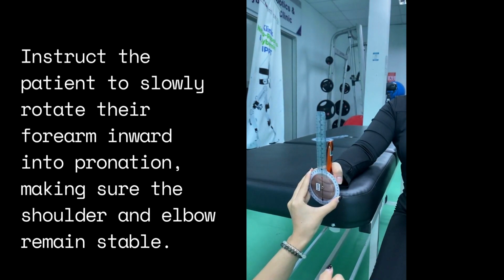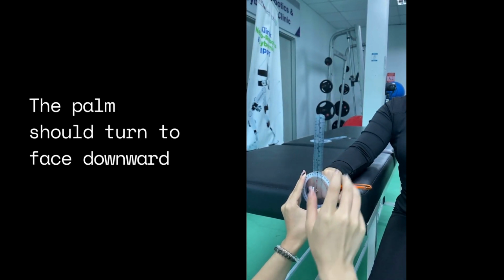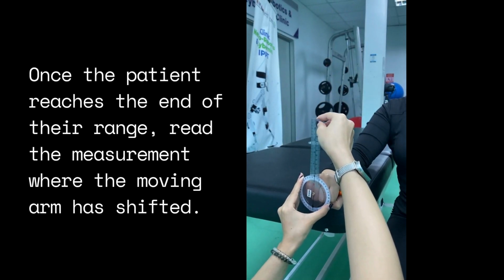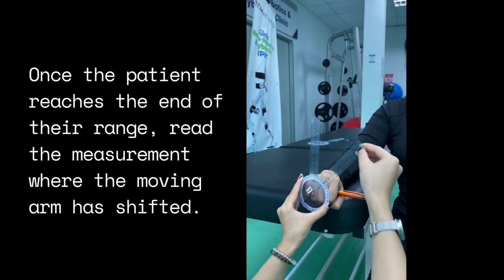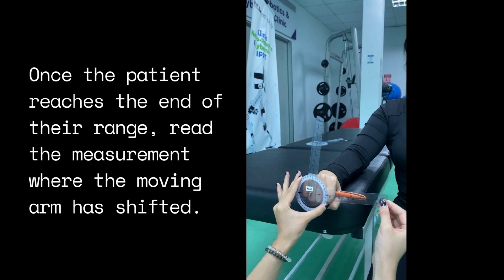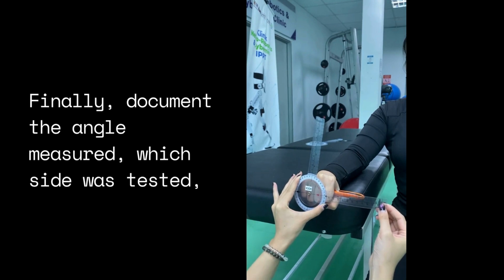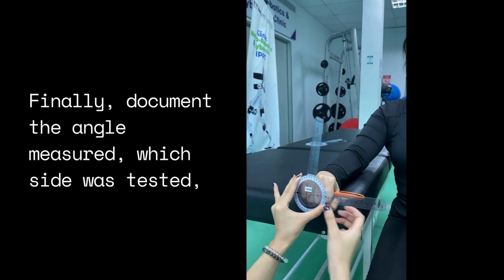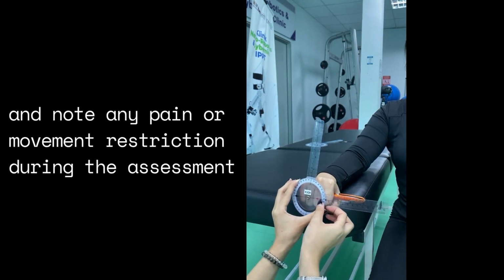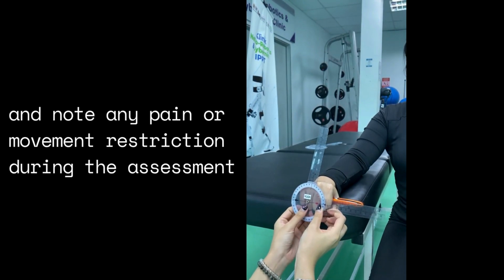Make sure the shoulder and elbow remain stable. The palm should face downward. Once the patient reaches the end of their range, read the measurement where the moving arm has shifted. Finally, document the angle measured, which side was tested, and note any pain or movement restriction during the assessment.